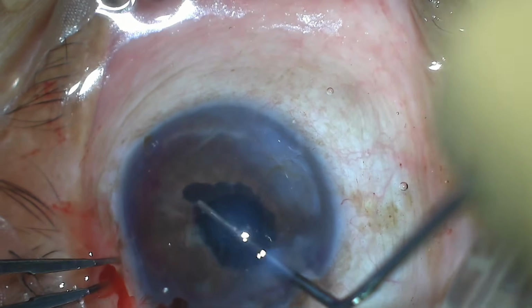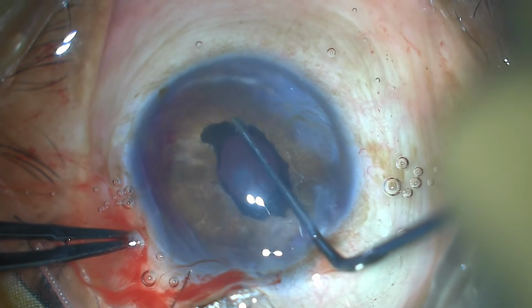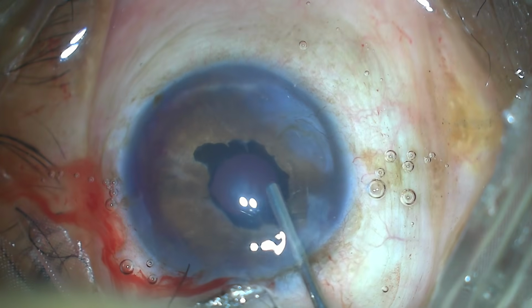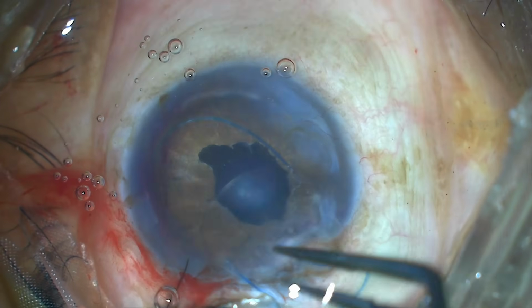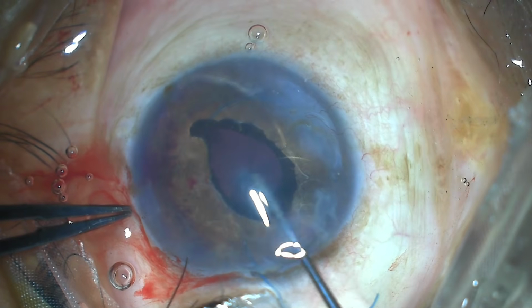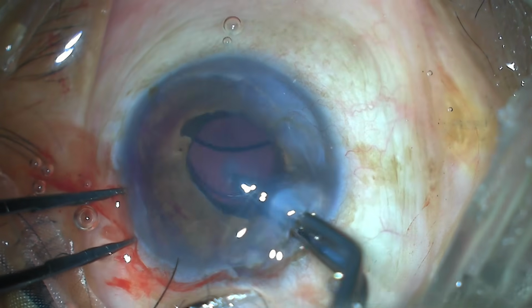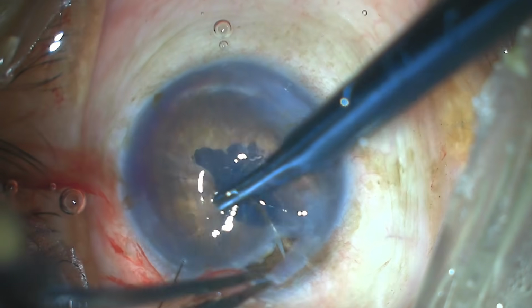Posterior synechiae was released from the capsular bag, and a +20 diopter, 3-piece IOL was put into the bag after checking for capsular integrity. The large wound was closed with 10-0 nylon.